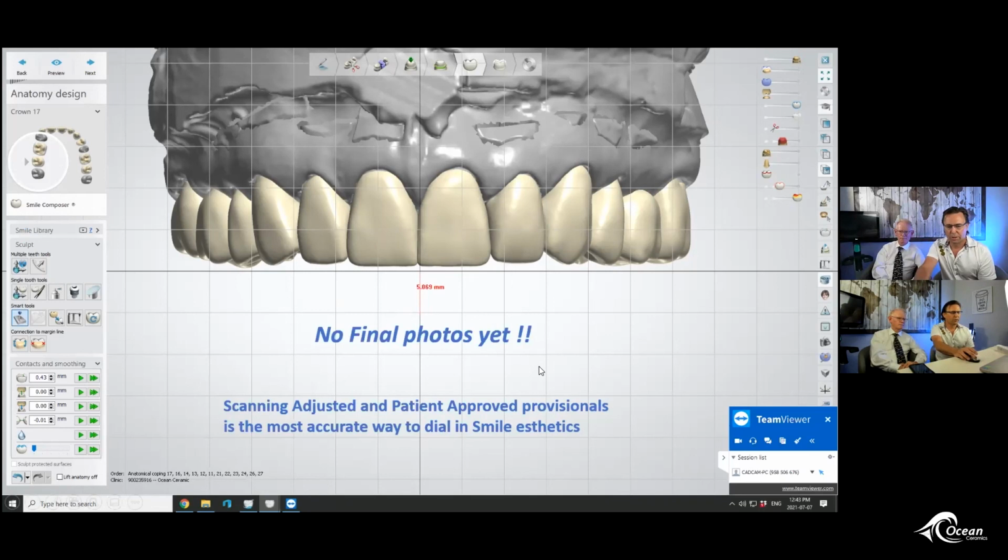But what I just want to stress, that scanning is such a luxury compared to the 90s when Steve and I were doing smiles, he'd be doing composite work up in the mouth, alginates, shipping wet impressions, and it was just so inconvenient compared to the luxuries we have today with digital dentistry. Now we can just scan. The original Polaroid was a camera that was like this long, had to be broken into 3 pieces and put into a case to be transported.